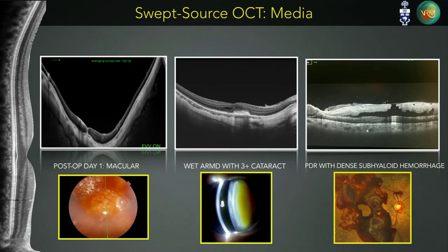So we knew preoperatively this patient had wet AMD, and that obviously they needed to be treated before they went into surgery. On the bottom right is another case we published in Ophthalmology. This is a bad diabetic with PDR and a pre-retinal hemorrhage. There's no view on this photograph of the patient's macula, and an OCT would end up being obliterated. We did a swept source OCT and very clearly could see subhyaloid hemorrhage, neovascular tissue, and the fact that the macula is actually fine. There's no macular edema in this case, just a lot of PDR and neovascular tissue that was bleeding. This kind of blood would have killed the machine in the previous iterations. You would not be able to get through that kind of blood.